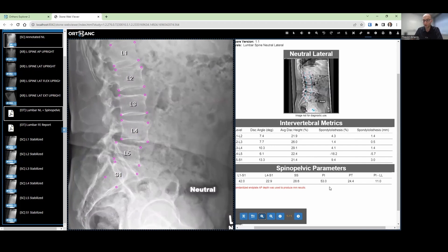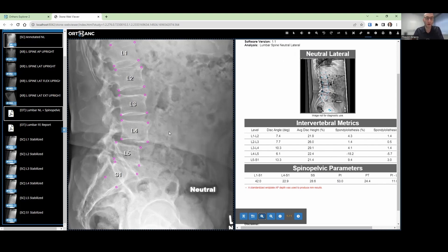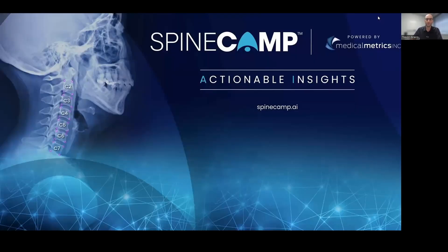So you can get all these measures on the fly, whether they're segmental alignment parameters or spinal pelvic parameters — pelvic incidence, pelvic tilt, mismatch — all available at the click of a button with SpineCamp. Thank you very much for taking the time to learn about how to use SpineCamp from your PACS. Looking forward to making this technology available to you.